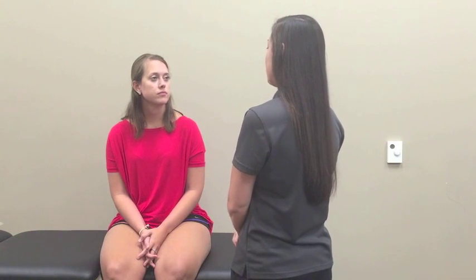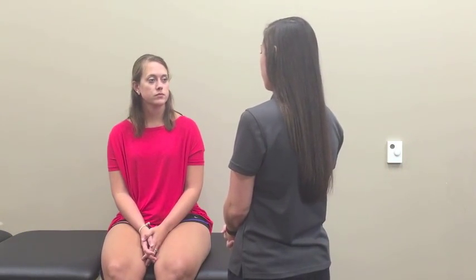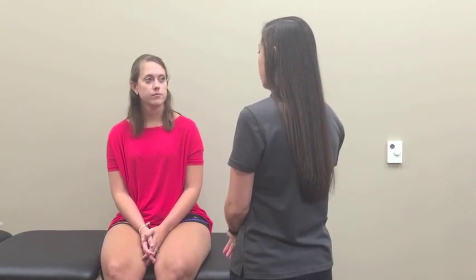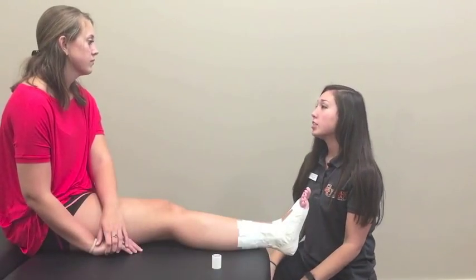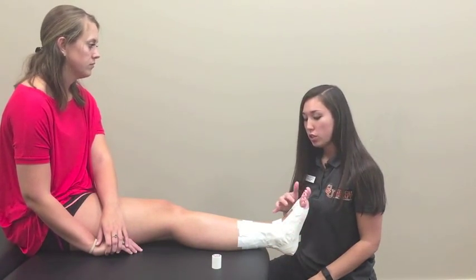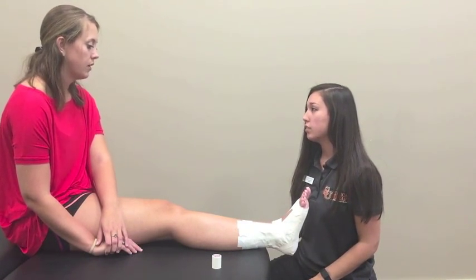I'm going to apply a taping technique to your ankle. As you can see, your ankle is swollen following the ankle sprain you experienced yesterday. This technique can help to add compression to the area to allow for the swelling to decrease. Along with the swelling, the taping technique can help to decrease the pain that you've been experiencing since the injury. Do you have any questions? So if at any point the compression gets to be too much, you can loosen these three final strips by using that flap that I added on the side.